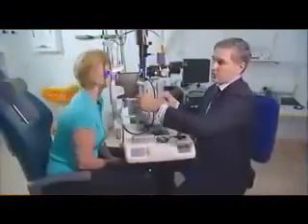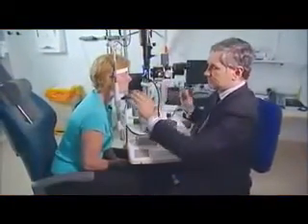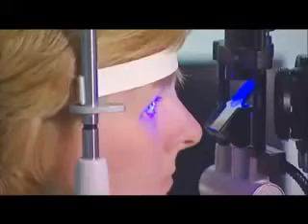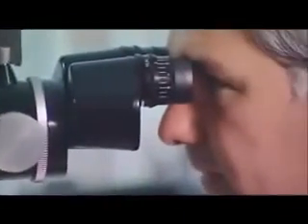With the patient looking straight ahead, fluorescein is instilled into the right lower conjunctival sac. The patient is asked to blink freely several times and advised that at some point they will be asked to stop blinking. The fluorescein-stained tear film is observed with the slit lamp, and when a homogeneously stained film is established at the end of the blink, the patient is asked to stop blinking and the stopwatch is started.